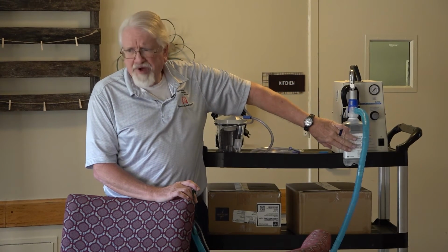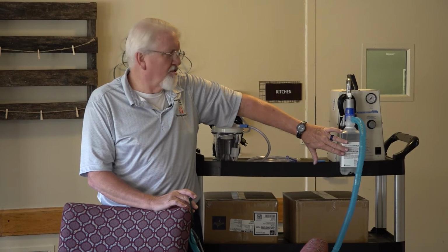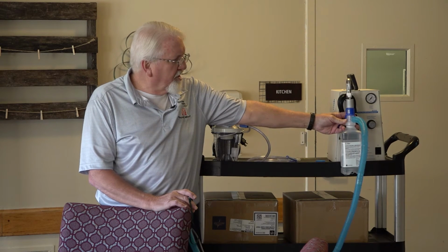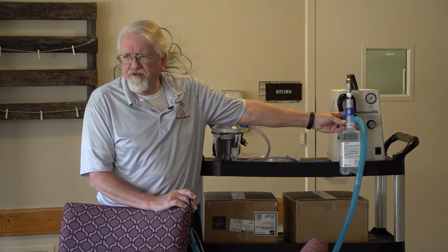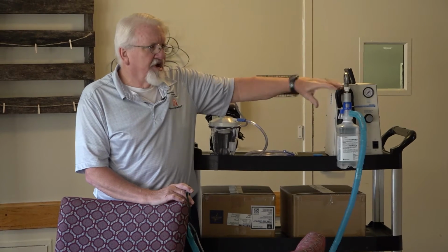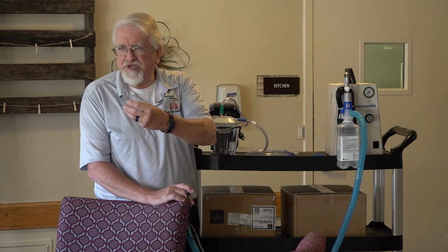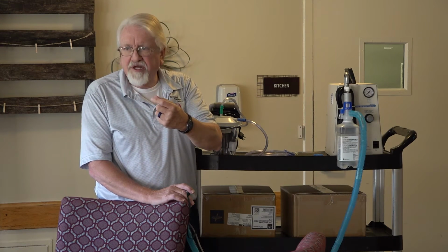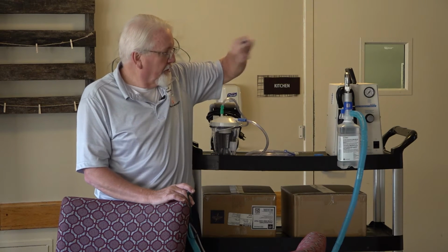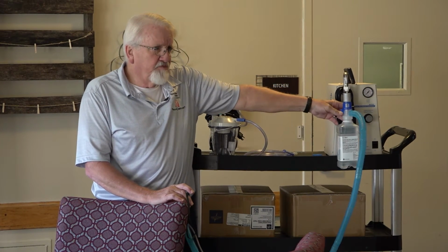Normally a 1,000 ml bottle is going to run you about a day and a half for a normal patient. So if I'm giving them too much humidity, I may want to cut this back to, say, go from 70 to 50 or 70 to 30. And what happens then is I've got more air coming in and a little less humidity going to the patient, okay? Because technically we can drown the patient. We can be giving them way more than what they need, okay? So does everybody understand the principle of the Venturi on the compressor?